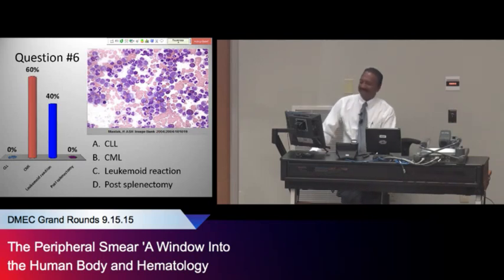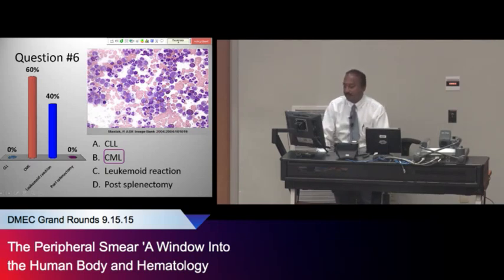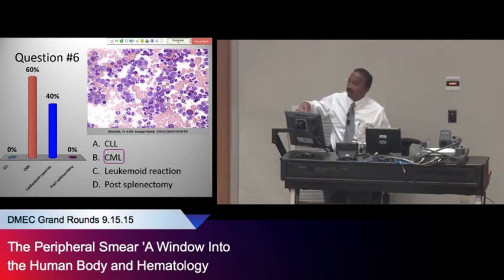CML, leukemoid, yeah. So those are 2 close differentials when you see them in the clinic or in the hospital setting. And the right answer is actually chronic myeloid leukemia. And the reason you would say chronic myeloid leukemia is because you see an entire sequence of maturation of the myeloid lineage here. So you'll see this, that's a band. You see this, that's a neutrophil. You see some myelocytes. You see some promyelocytes. This is a metamyelocyte. You'll see an odd occasional blast mixed in that circulation. So the entire maturation lineage is available, and you'll see some peripheral neutrophils as well. And that's very classic for chronic myeloid leukemia.